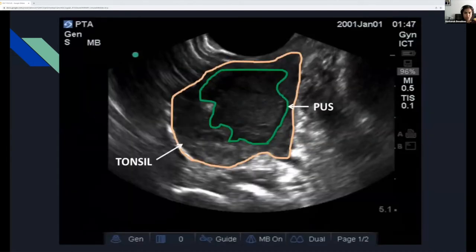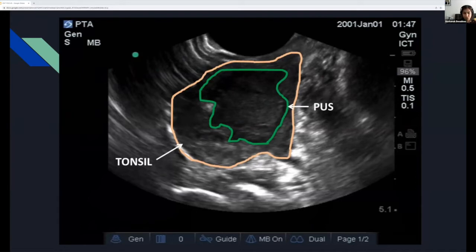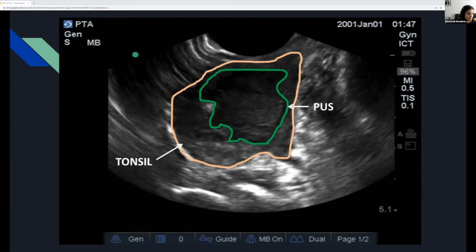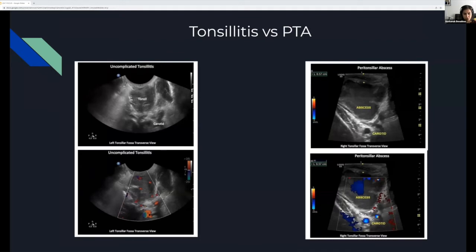This is another visualization of the same thing — you see the pus and the collection. You can either stop here, confirm the abscess is there and there's something to aspirate, then withdraw your probe and aspirate landmark-based and blind; or you can do it under ultrasound guidance. Some studies were done by just visualizing the abscess, without performing the aspiration under ultrasound guidance. Either way, remember how close the carotid artery is — you can see it under ultrasound as well, very close to the posterior wall of the abscess.